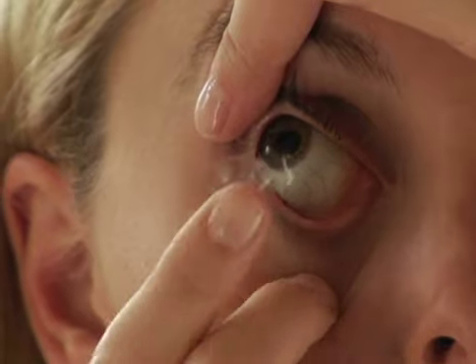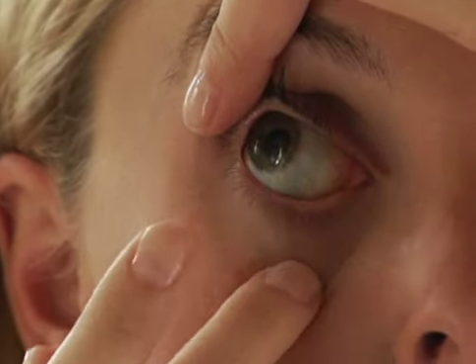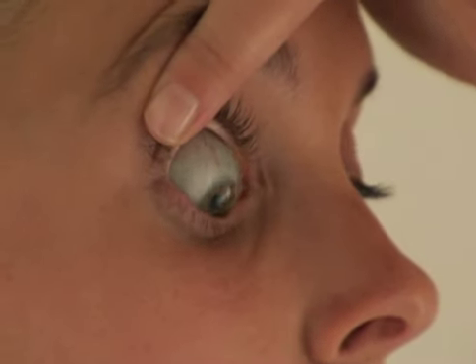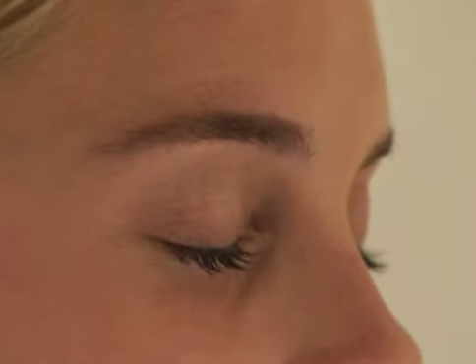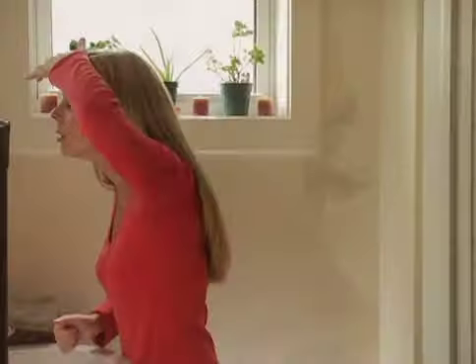Sometimes, small dust particles or an eyelash can get trapped on the lens during its insertion. This may cause discomfort. To remove this debris, gently slide your lens off, repeat the rinsing process if necessary, and place the lens back on your eye. Always ensure to rinse the lens properly, and while looking upward, place it gently on the white part of your eye.